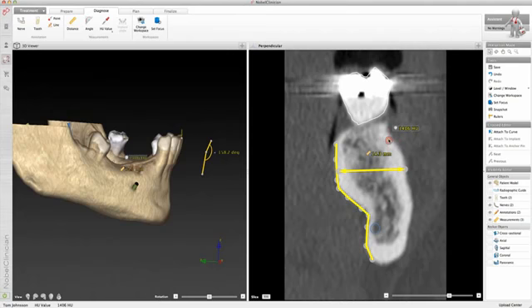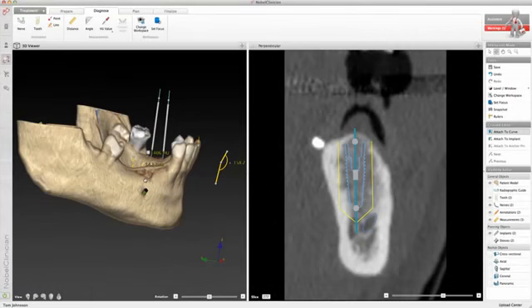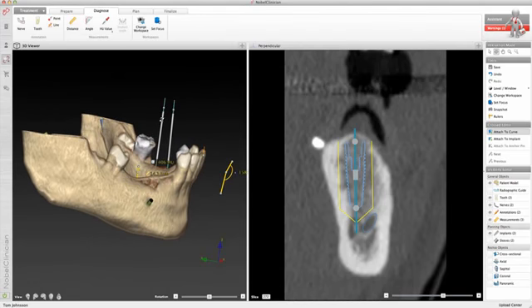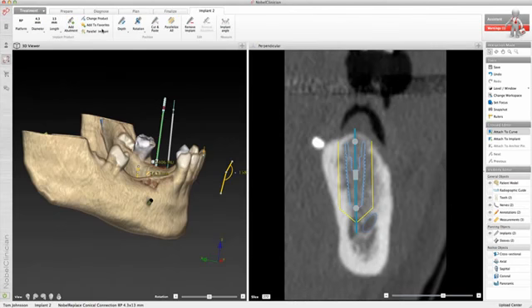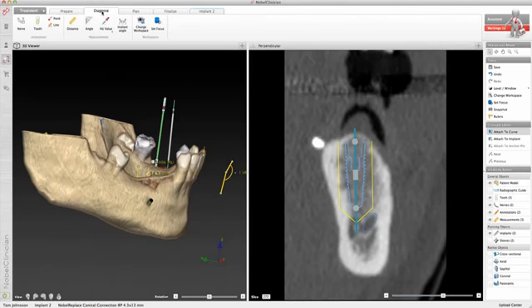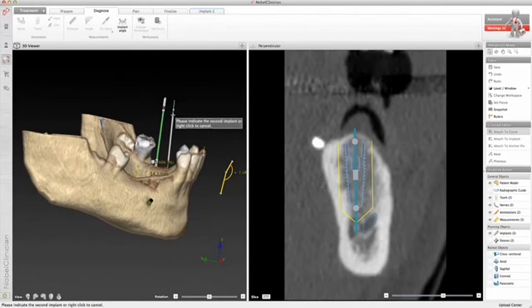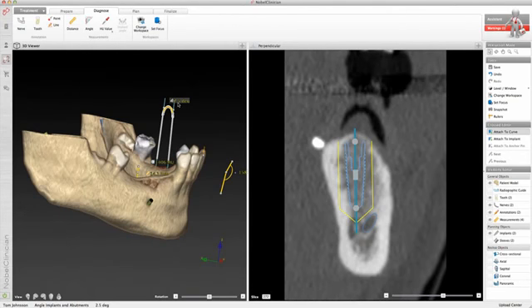Angles between implants can be measured once the implants have been planned. To measure the angle between two implants, select first one implant by left-clicking on the implant in the 3D viewer. The implant angle icon becomes active. Press this icon, then select the second implant by left-clicking on it in the 3D viewer. The measurement is shown in the 3D scene and at the bottom left corner of the screen.